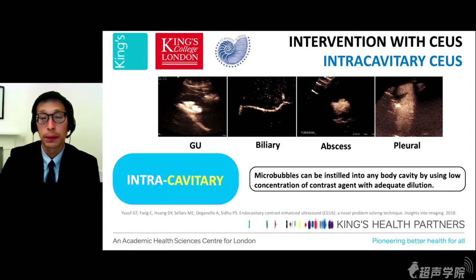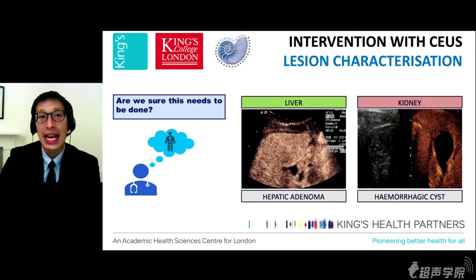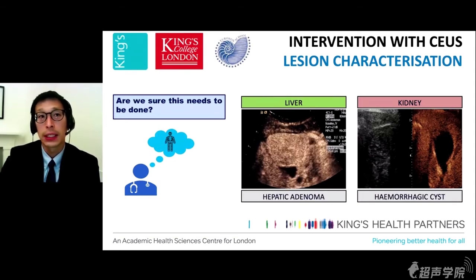that's well established. Talking about different procedures, one of the most common procedures that's performed under ultrasound guidance is biopsy. And I think before we start biopsy, contrast ultrasound has the added value in providing superior diagnostic ability, and it may help you to identify a lesion which demonstrate benign features and prevent you from performing an unnecessary biopsy or causing unnecessary complication relating to the procedure.